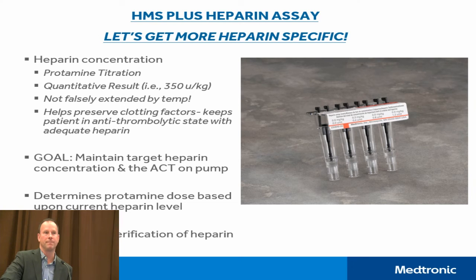So that's a common scenario when I'm getting new people up online: if you're near target, you're at target. So if your instrument wants to monitor a 360 and you're at a 350, I wouldn't keep giving that. That's just me personally. Don't want to tell you how to do it, but I wouldn't keep giving that incremental amount because you're at target.